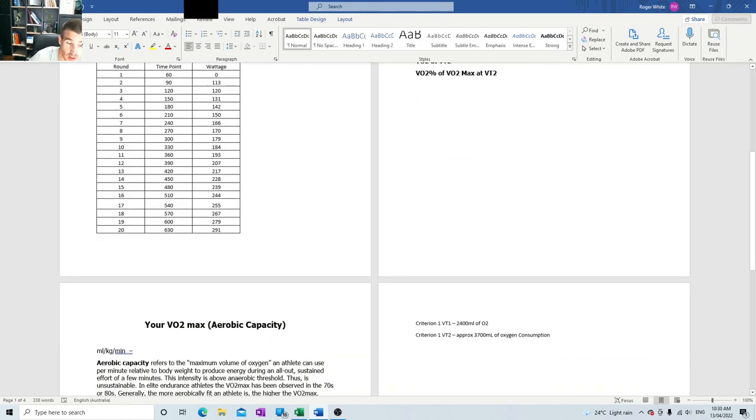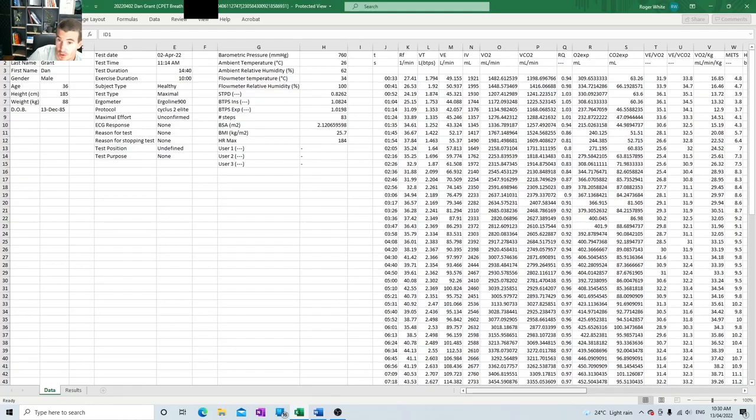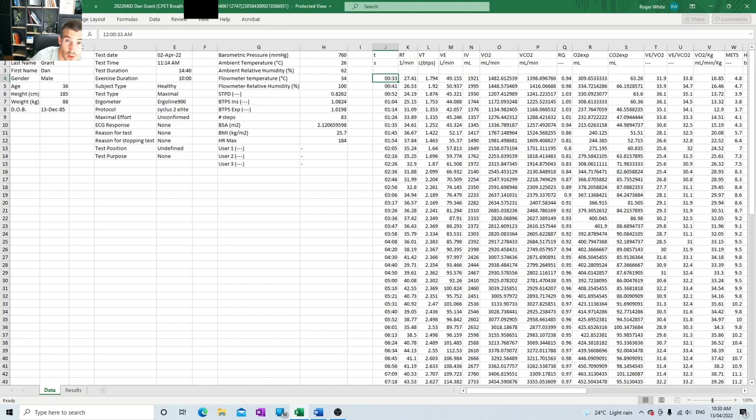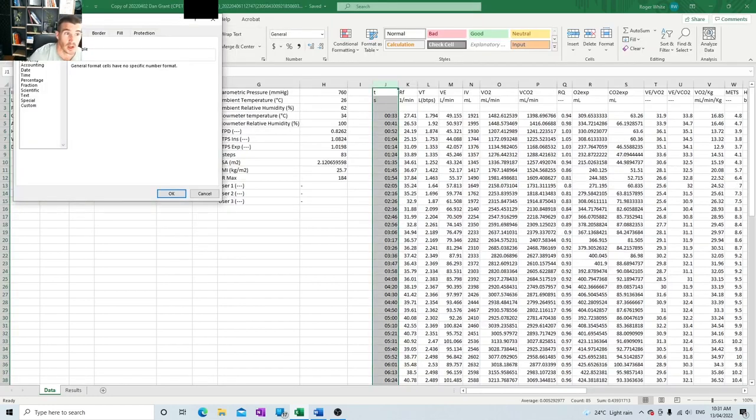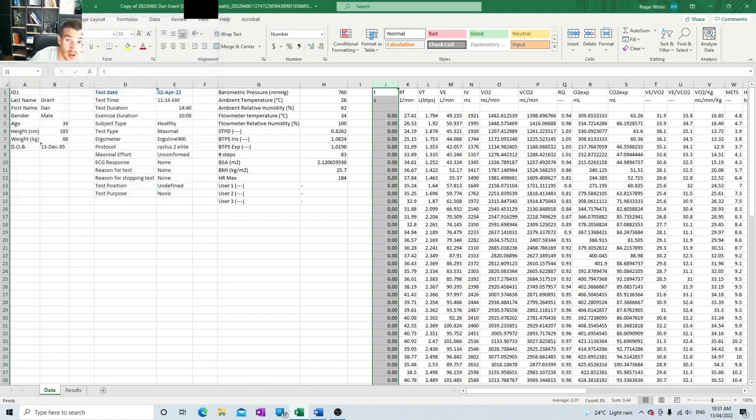So the first thing I like to find is their VO2 max. So I'm going to show you how to do that now. The first thing to make a VO2 max graph is with the COSMED quark, you get this as your time, which doesn't really make sense. It looks like it's in the format of 12 a.m. So we want to change this to number. So we just go control one and then we can convert this 12 a.m. to number. So then it's in number format.